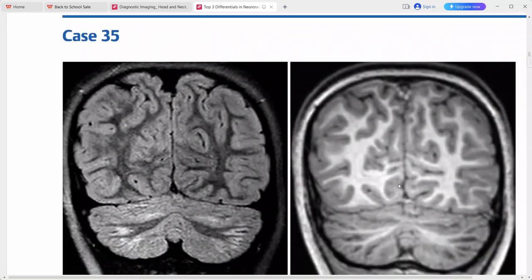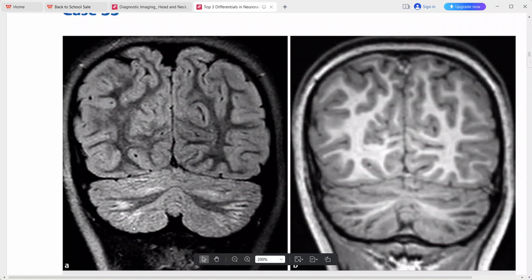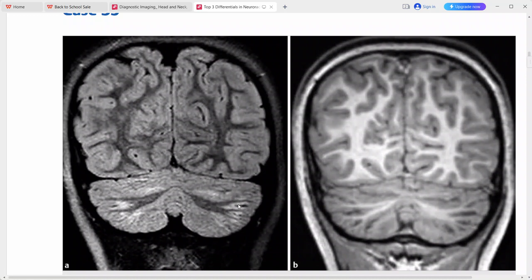This is a case of a ten-year-old boy presenting with new onset ataxia. On the coronal FLAIR sequence there are confluent regions of increased signal intensity showing hypointensity on T1, predominantly involving the subcortical white matter of the cerebellar hemispheres. Post-contrast sequences were not shown but no enhancement was present.